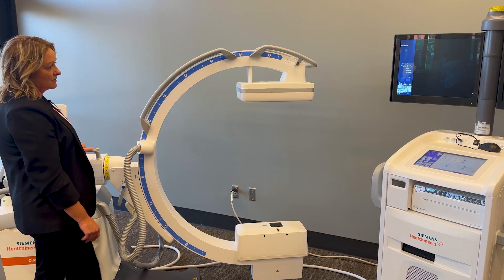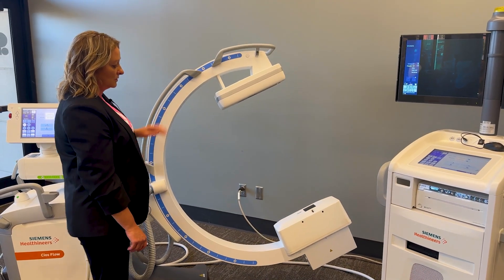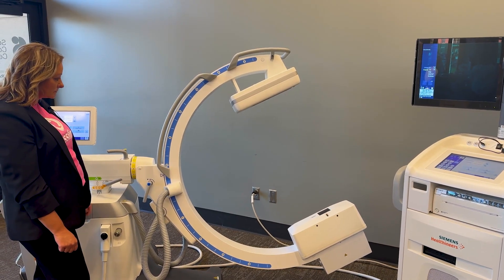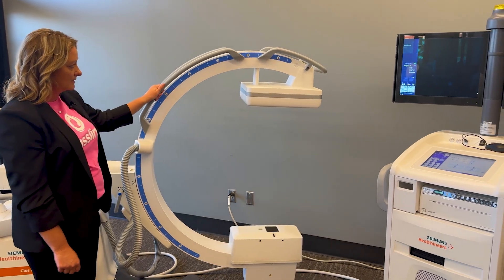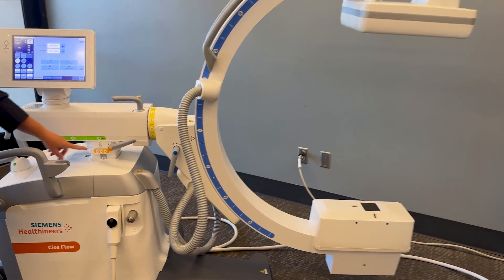It is also counterbalanced so you do not need to re-lock after you unlock. Color-coded locks are unique to Siemens and are the same throughout our C-Arms.